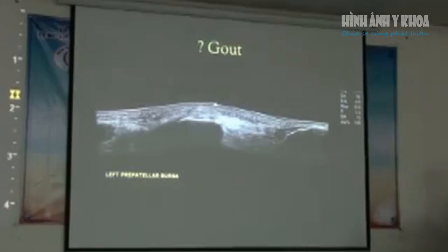And you can see here that the subdermal thickness just underneath the skin is quite thickened.